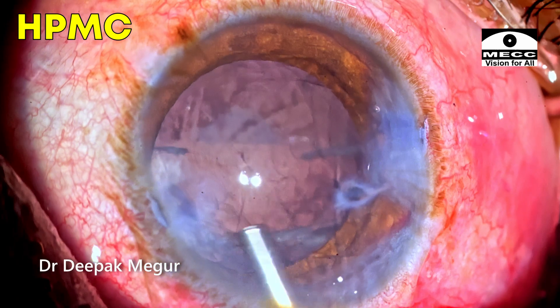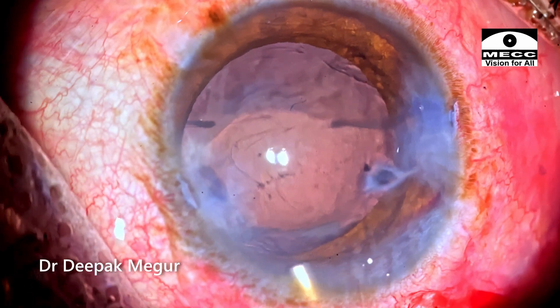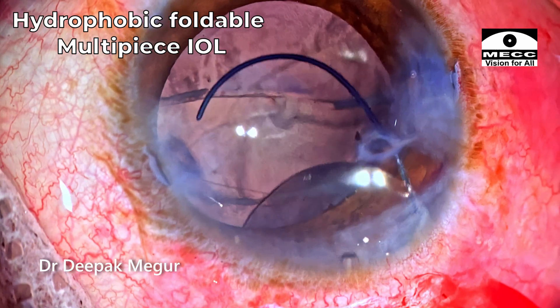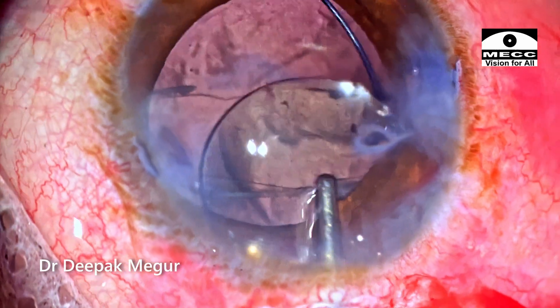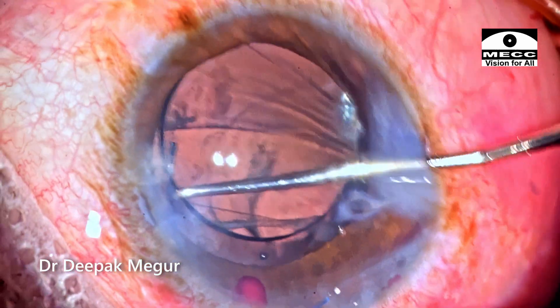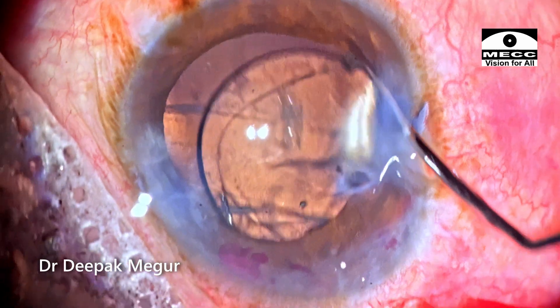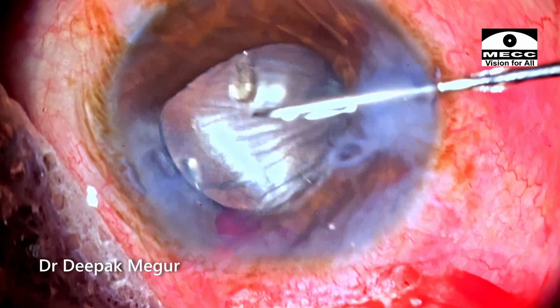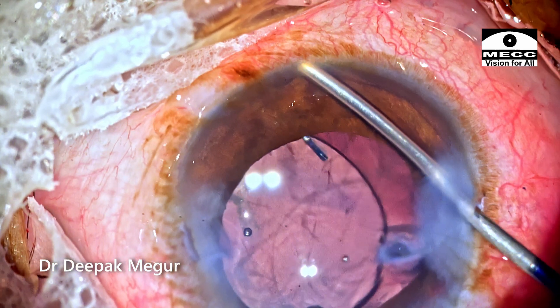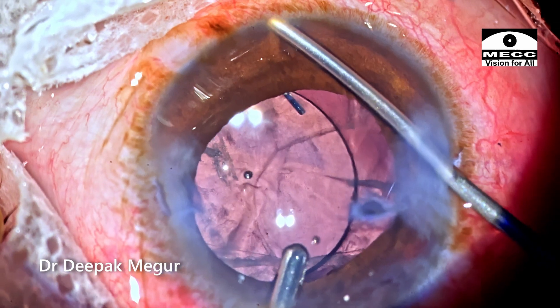Since the incision is large enough, I'm using the same foldable hydrophobic multi-piece lens but introducing it in an unfolded form. Once vitreous has been taken care of adequately, placing the lens over the anterior capsular flaps is going to be very easy. Since the eye could be very much inflamed in the post-op period, I would want to use a peripheral iridectomy to help in the event of severe inflammation and minimize pupillary block.